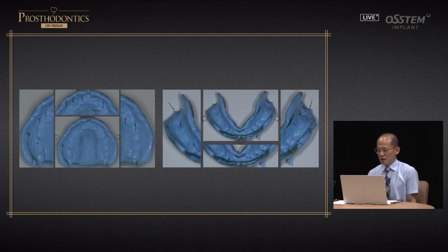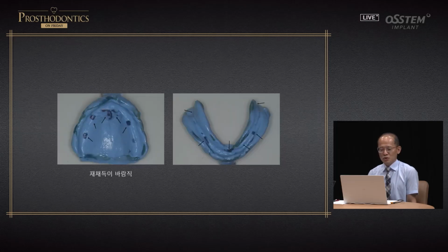If you take an impression and hold on to it, and compare it against the full denture after it has been delivered, then you can find the problem spot. Except if there is this type of pressure, adjustment alone would not be sufficient, especially if you have used the metal base from the implantation stage. You have to take the impression again and solve it at the impression stage.